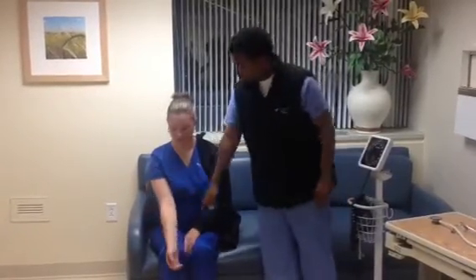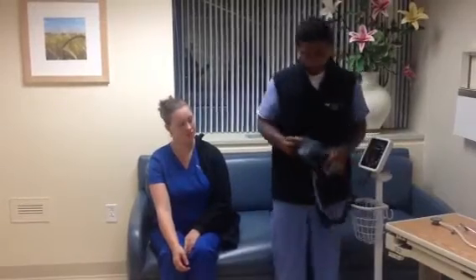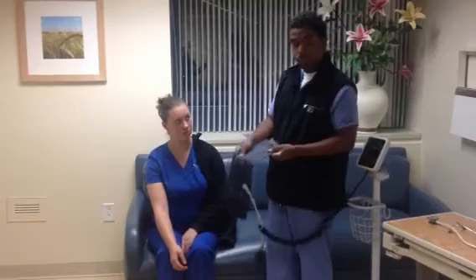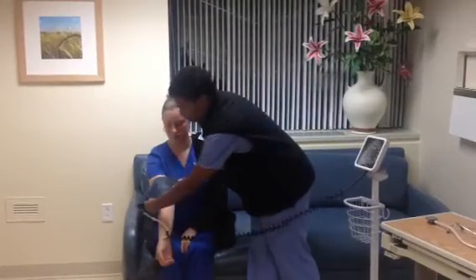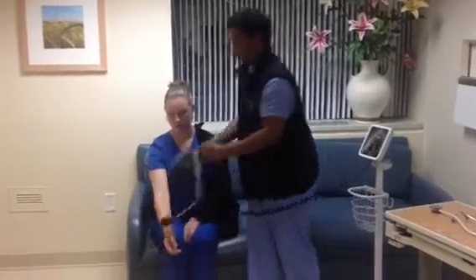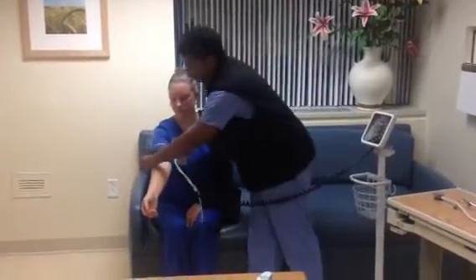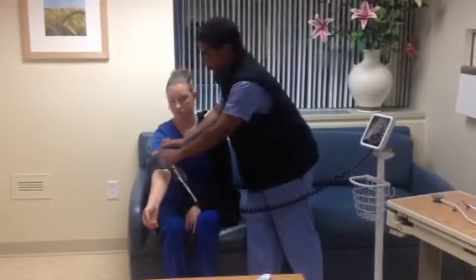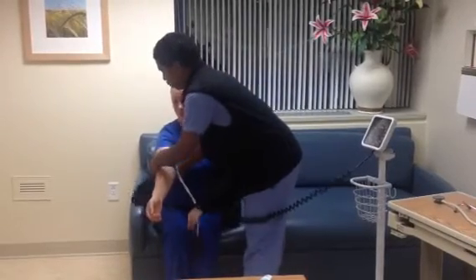She will remove her right arm sleeve. I will size her arm using the measuring device, as we did earlier, and notice that the cuff is the proper size. I will place the cuff with the artery line towards her antecubital and wrap it around her arm.